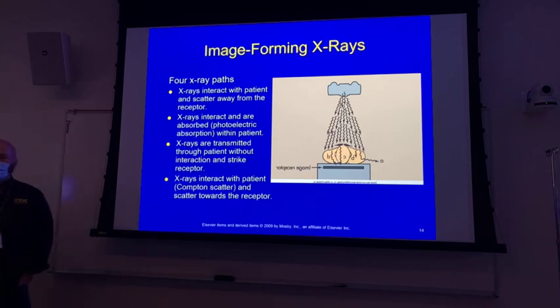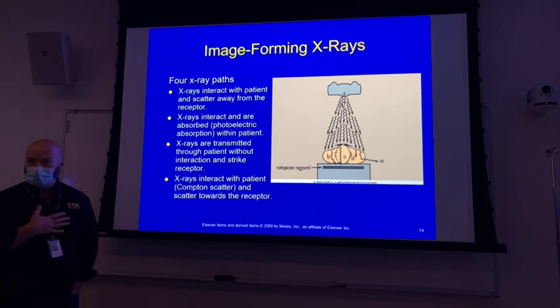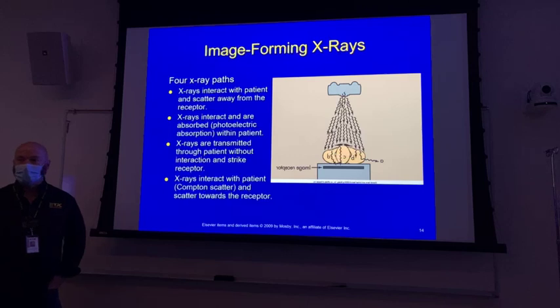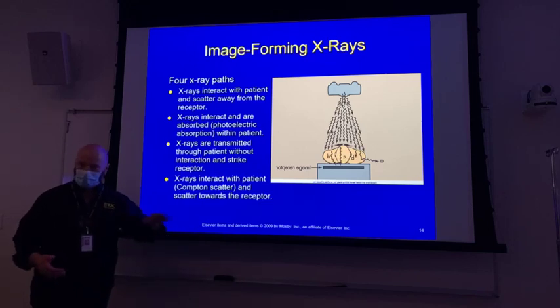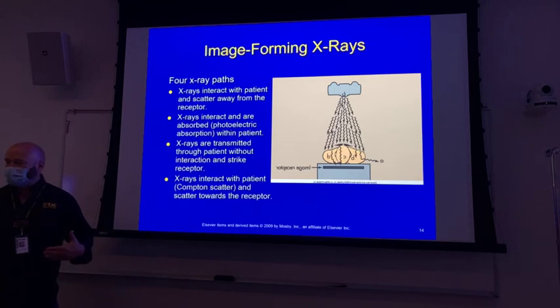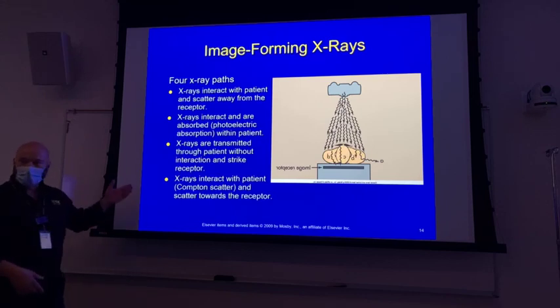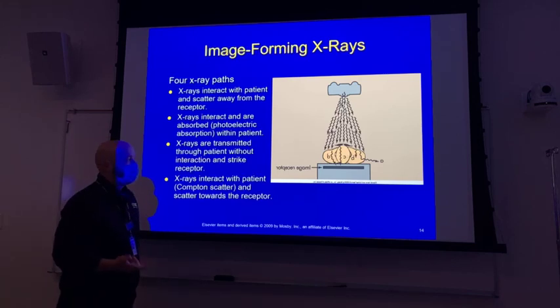And then shielding, what are you going to do? First off is wear your lead, right? But secondly, get behind a barrier if you can, right? From that point on, when we were making those cross-table lateral L-spines and we were shooting directly into that wall, do you think we stood right there behind the control panel? No, we went in the bathroom, right? We went around the corner into that hallway as far away as we could. Okay, so time, distance, shielding, use it.